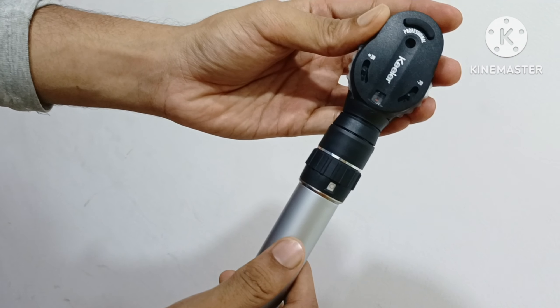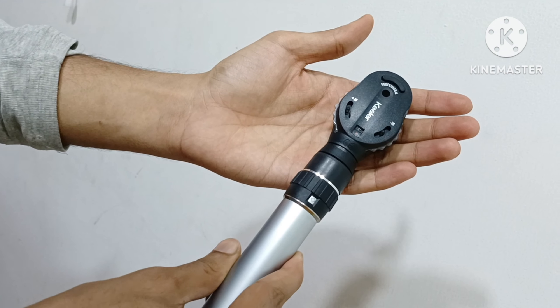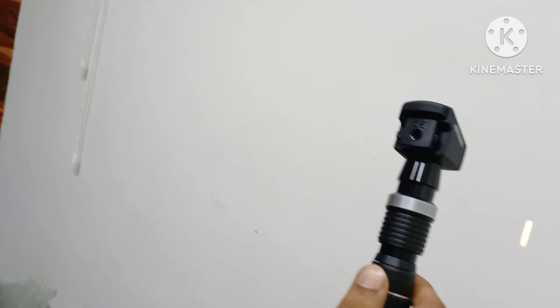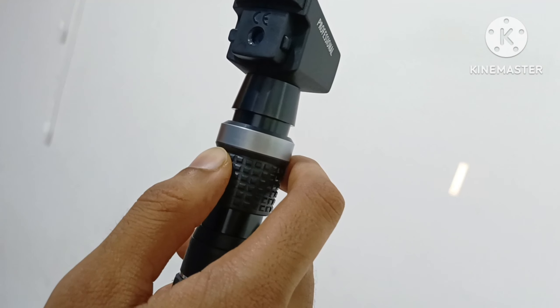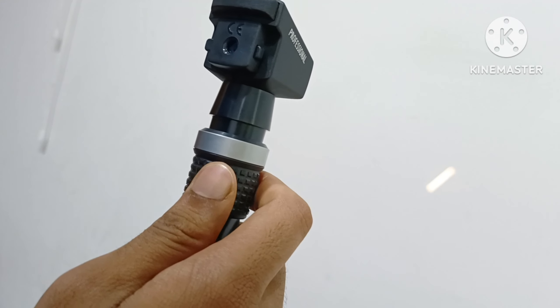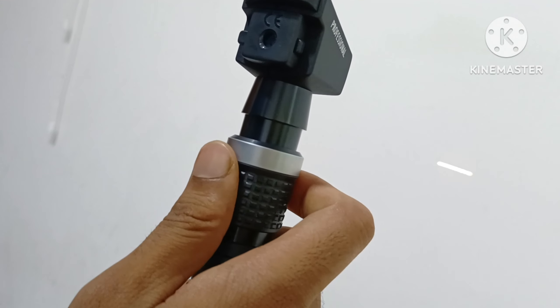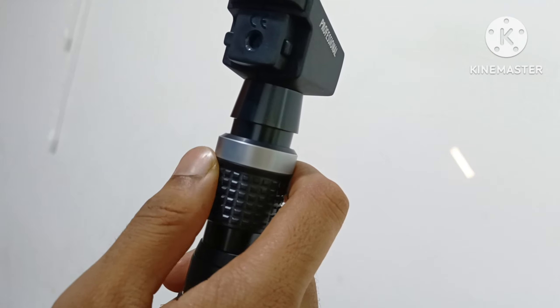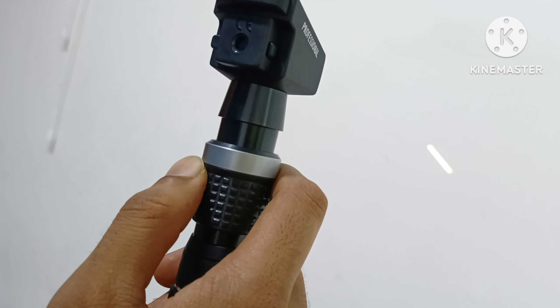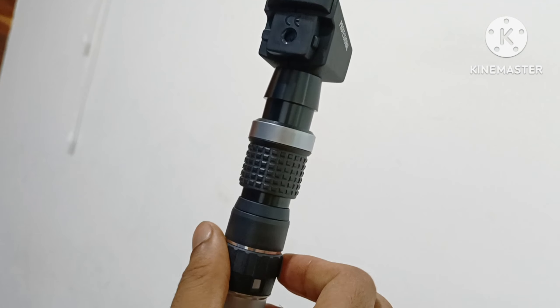Professional ophthalmoscope, retinoscope. Slit control 0 to 360 degree rotation, width and slit, illumination control available.